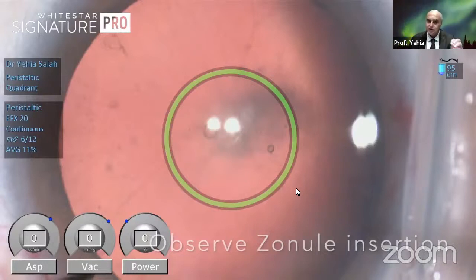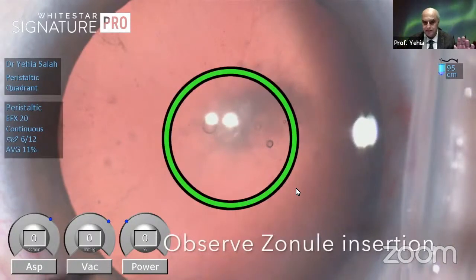And as I told you, it's called long anterior zonule syndrome, LAZS. It can be complete, which is less common, like this case, or partial. So you have always to look at this. Once you see it once, you recognize it. And these patients have a genetic predisposition to get glaucoma, and usually they will do so after the cataract surgery. So this is, again, a major challenge for you to spot this patient and do the proper surgery, proper planning, not to get into the problems I got, and to observe the intraocular pressure postoperatively to avoid any unattended glaucoma.